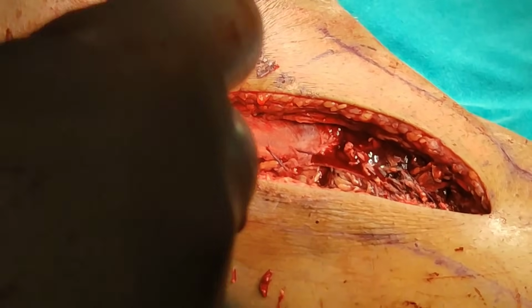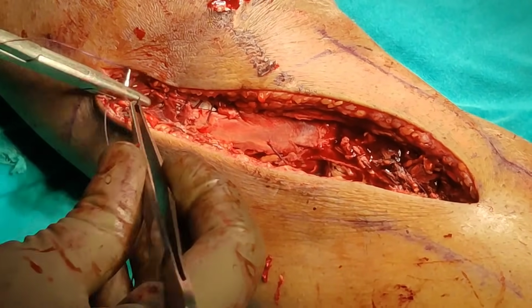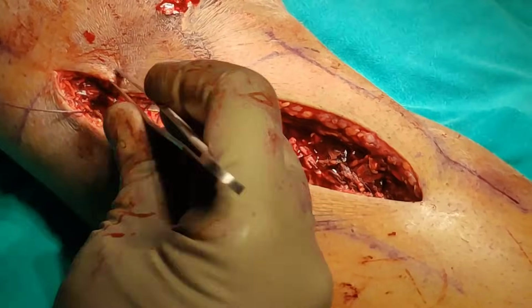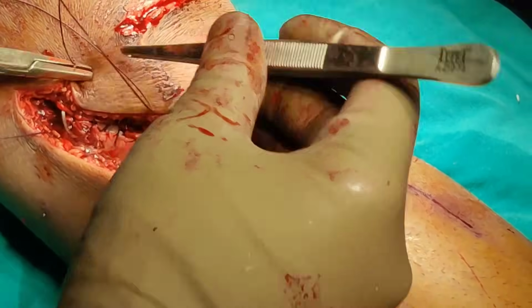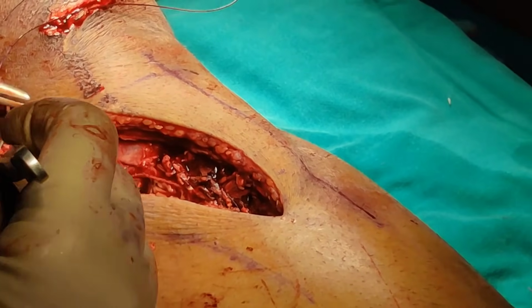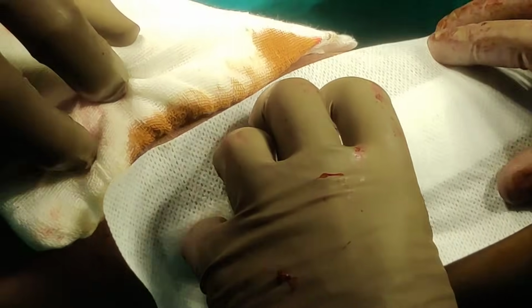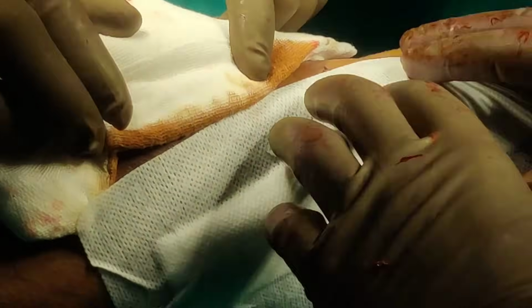Now it's just a matter of closing our straightforward dermis layer. So I'm just going to run a continuous stitch, and then I will use either some Ethilon or some skin staples. So this is our wound beautifully closed. So we are just going to apply some gauze and some pressure dressing. I keep them in ROM so that they can start moving their knee from day 1. I will start weight bearing from roughly around 6 weeks.